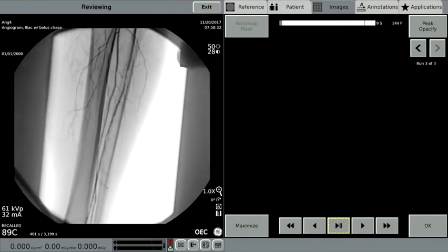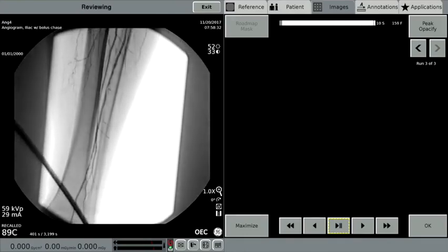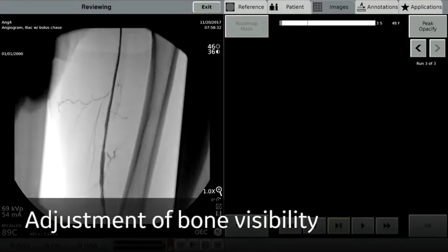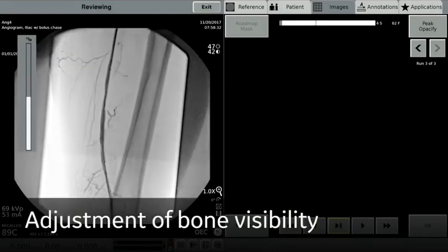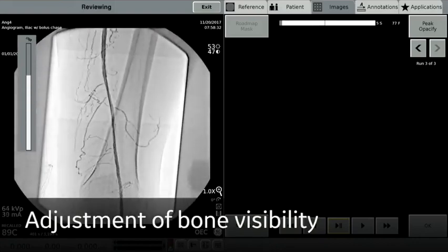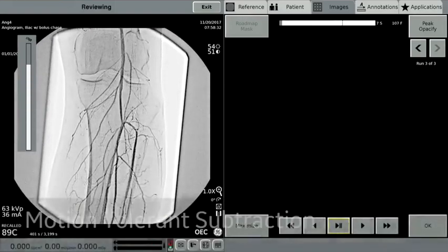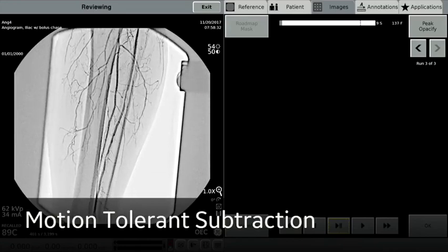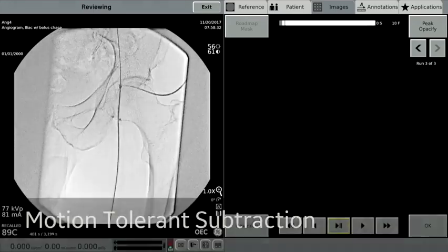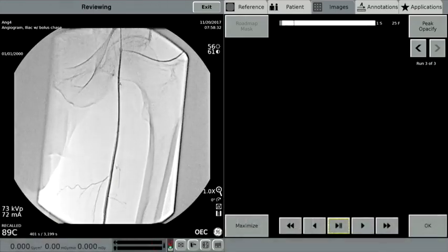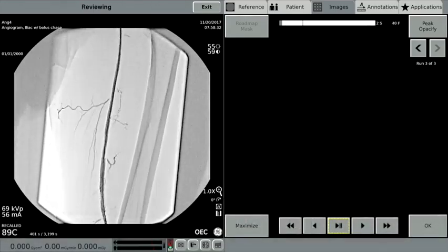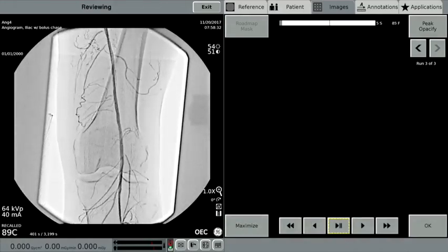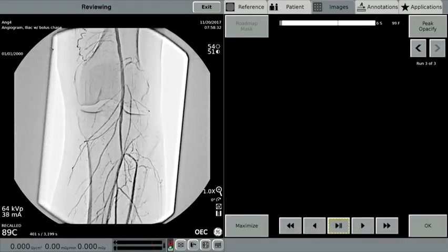The clarity of the vessels in this image is achieved by OEC's MTS, Motion Tolerance Subtraction Software. MTS produces images that de-emphasize the prominence of bony structures during movement in the image, resulting in visualization of superb vascular detail throughout a bolus chase run.